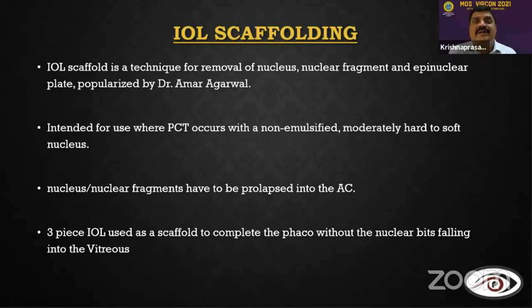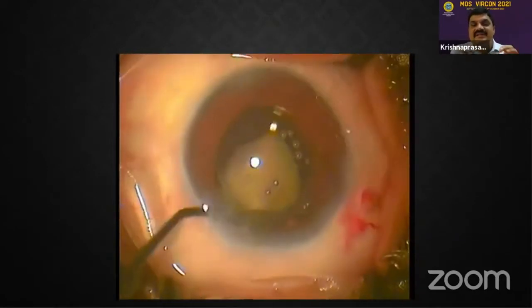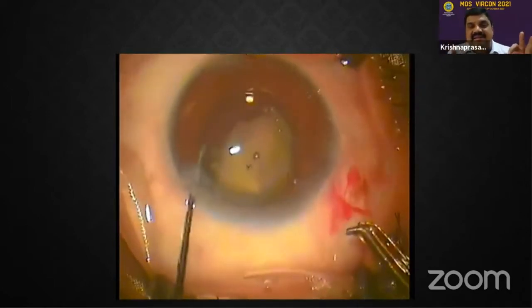But one important technique Athiya madam already told, which has been described by our great friend Dr. Amar Agrawal, is none other than the IOL scaffold, where the IOL itself will act as a scaffold to prevent the nucleus from going down. See, this is one video I picked from one of my friends. You can see here, there is already a rent.